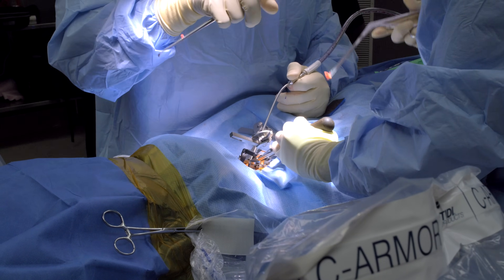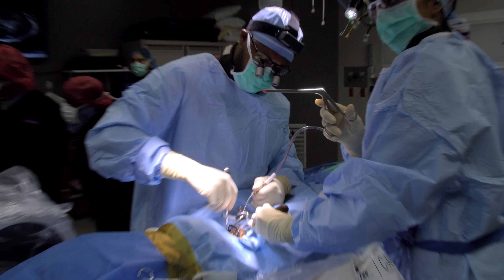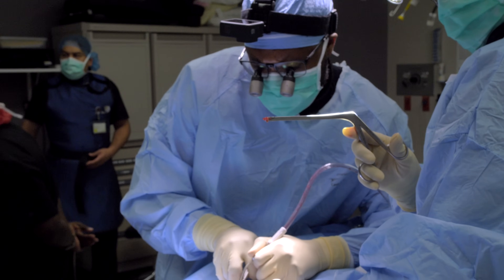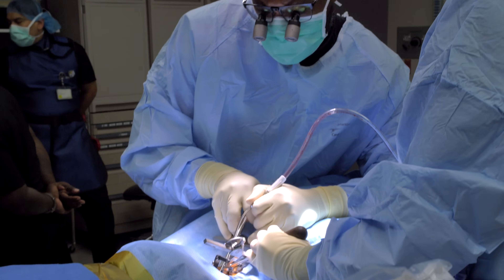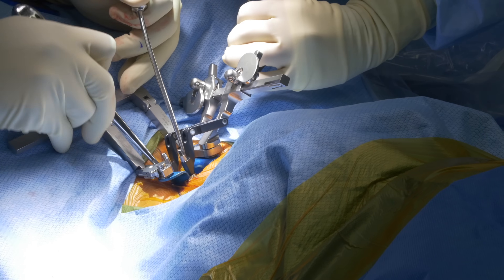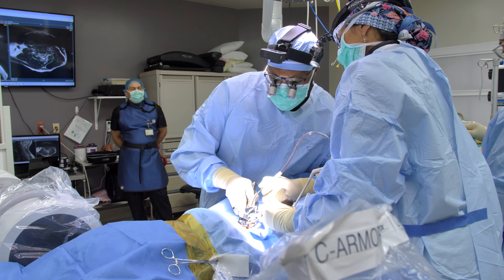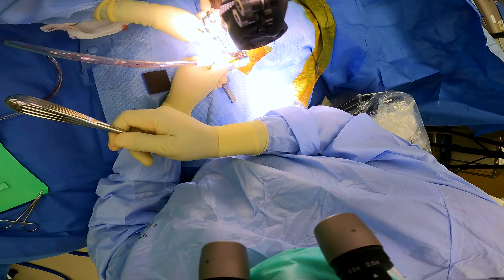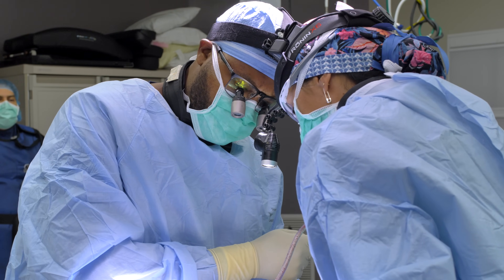This is the disc that we're removing here. This patient has severely tight spinal cord and foraminal stenosis, which means that his nerve root is really tight. He presented to my office with really severe neck and arm pain. We're cleaning out the disc now, removing the disc, performing the discectomy portion.